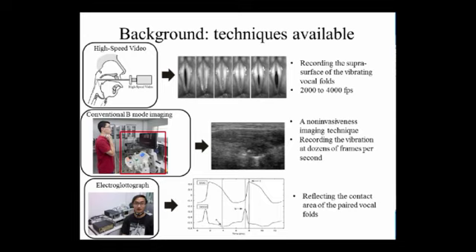Here I also want to introduce another technique that we used later. It's called electroglottogram, and basically it can be used to record the contact area between a pair of vocal folds during the vibration.